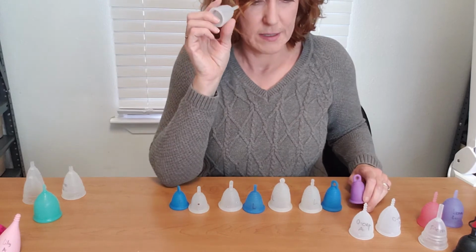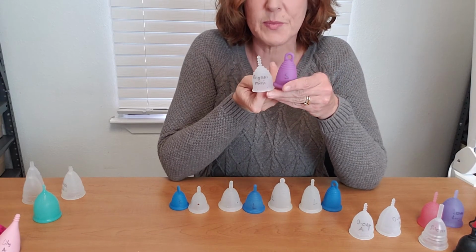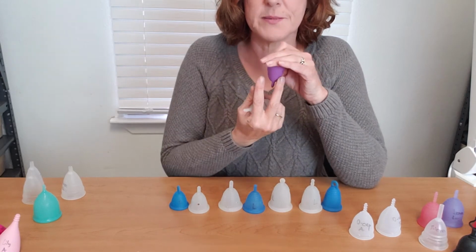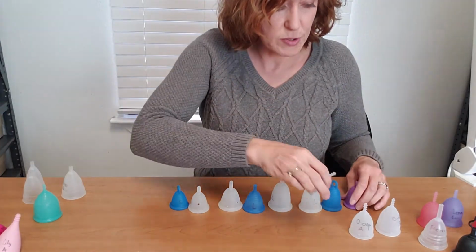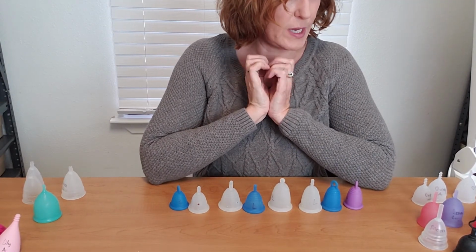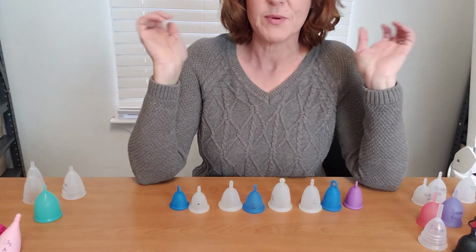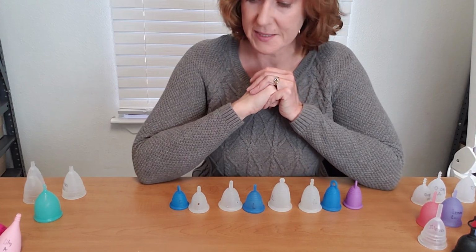So if your Organic Cup Mini is too tough to reach, you could consider the small standard Meluna. It's taller in the body itself, but it's also very narrow, so great for teens. And reach up, release the seal first, and then pull it out. If you're not quite sure how to remove a menstrual cup, I would suggest you check out our video on removing a menstrual cup. If you have a menstrual cup that sort of works for you, but it's just the handle that bothers you, we encourage you to try and find a solution with the cup that you already own. We have a video that's titled, "Is Your Menstrual Cup Too Long?" That could help you with that.